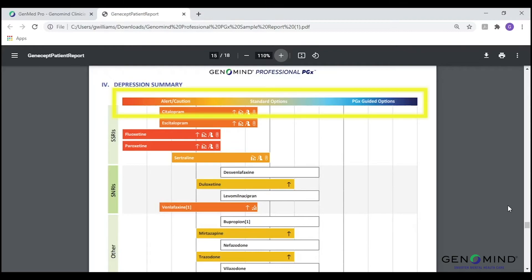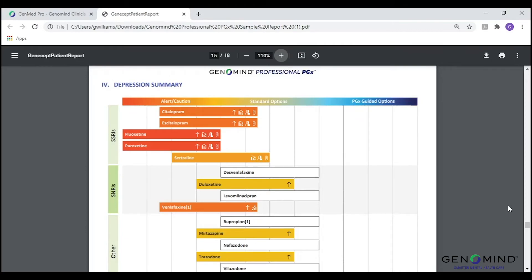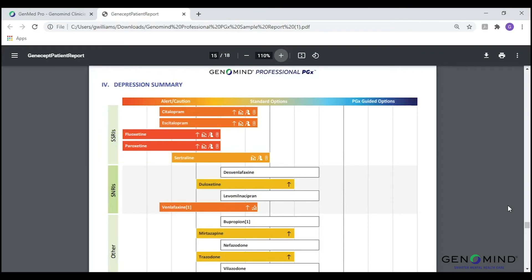At the top of the summary page, you will see three columns: alert or caution, standard options, and pharmacogenetic or PGX-guided options. Medications or therapies that appear in white and are not shifted from the center of the graph indicate options with no gene-drug interactions. A shift to the left of the page indicates a genetic alert or caution associated with this drug, such as a higher drug exposure. The more significant the genetic variations, the greater the shift will be on the graph. These boxes will also appear in a yellow, orange, or red color. Notice how paroxetine is shifted to the left of the graph under alert or caution. This would signal that there are important factors a clinician will want to review prior to considering or utilizing paroxetine.